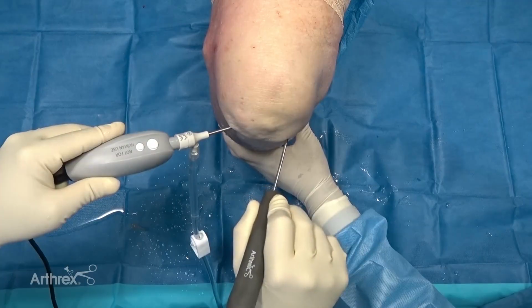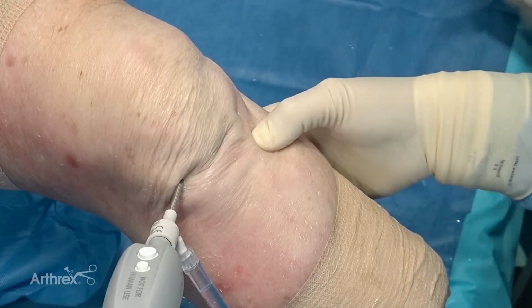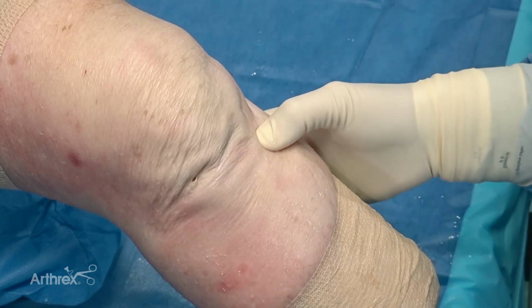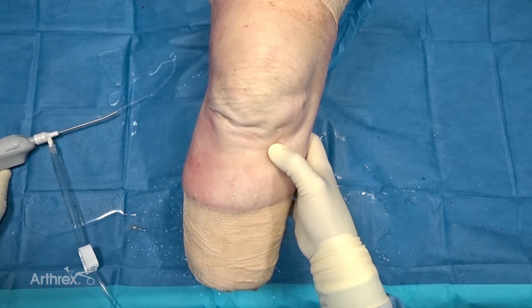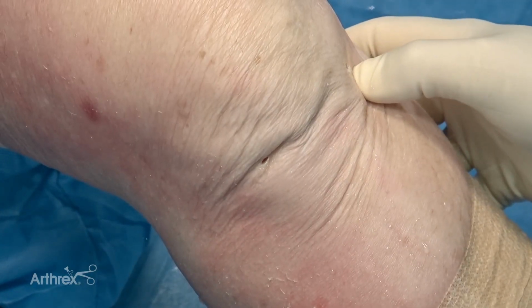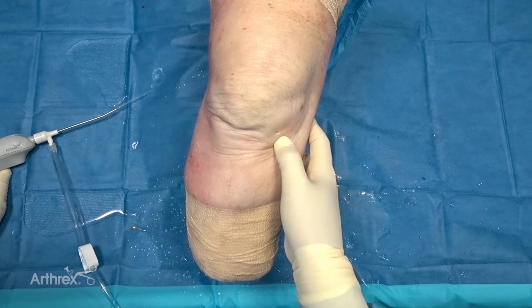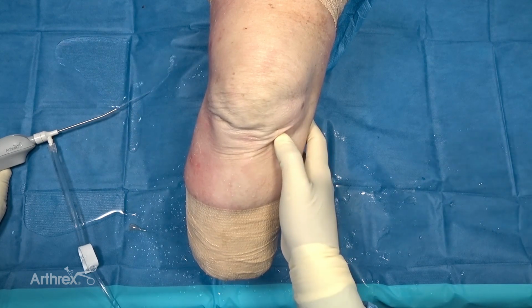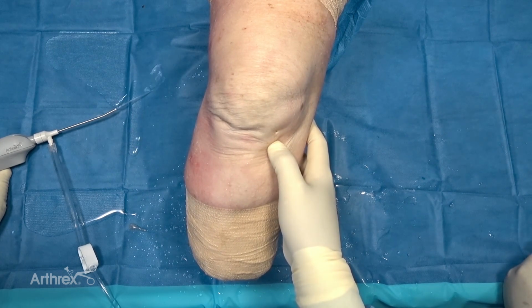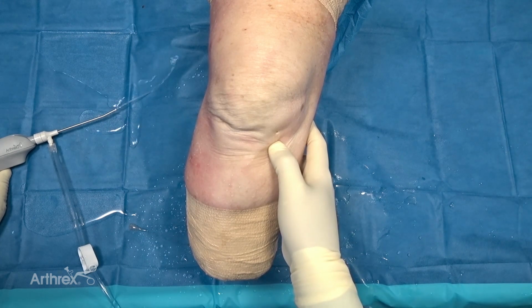So you can take a look at the knee, and I'll just slide out here. As you can see, we've done the partial medial meniscectomy. We'll focus in on the knee joint here as we remove the nanoscope at the medial and lateral sides. You can see just percutaneous portals. You can just use a band-aid. You may want to use a small suture to close, but nothing more than a single suture. This patient, in 2 to 3 days, will be feeling like they barely had surgery. I've had patients go back to their jobs within a day, standing all day long.